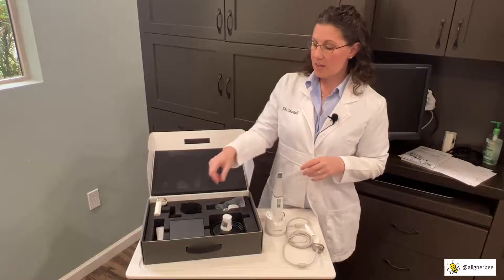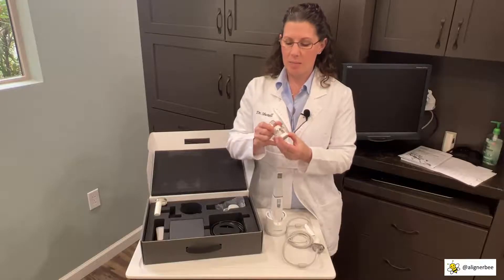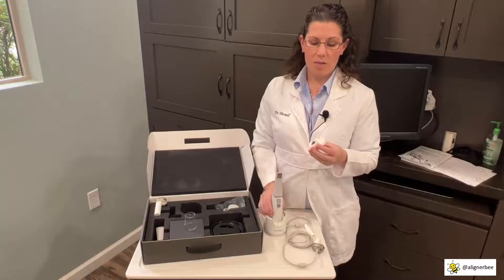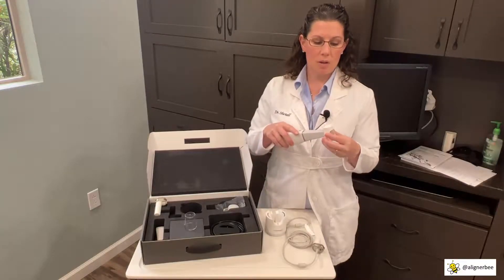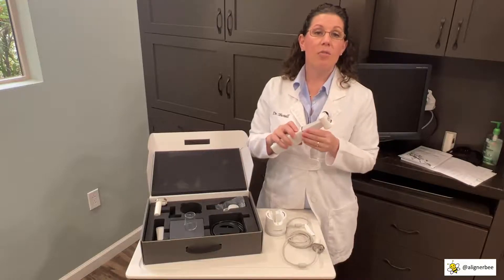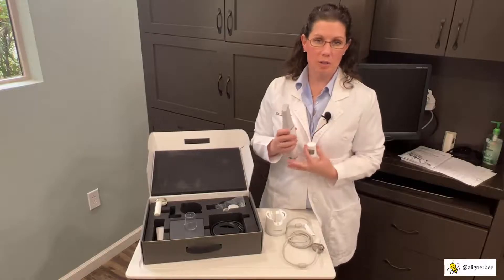As we continue with our unboxing, there is a calibration tip for the color calibration. This is used by placing the tip into the calibration station and running through the calibration steps. This will be reviewed with you during training.